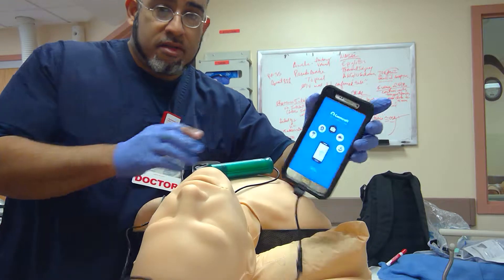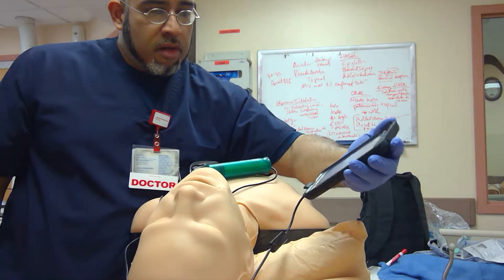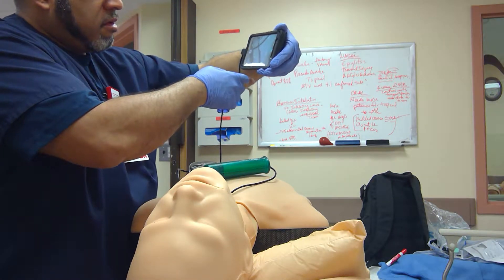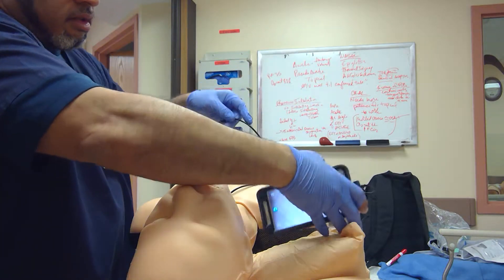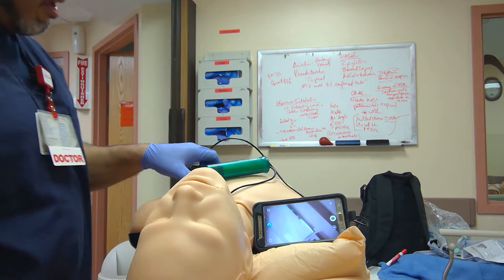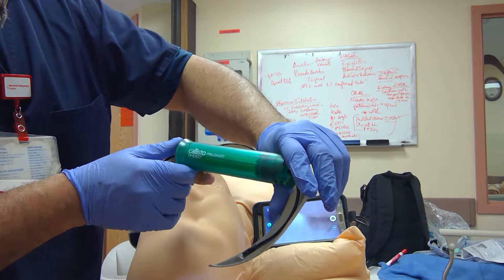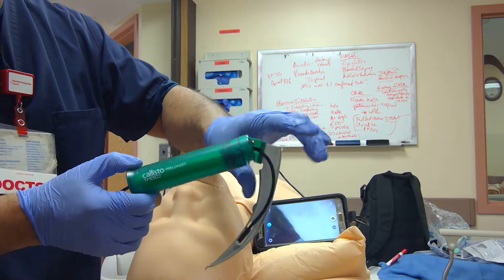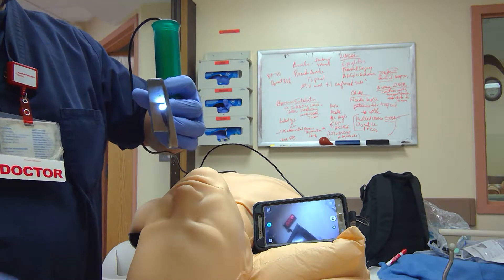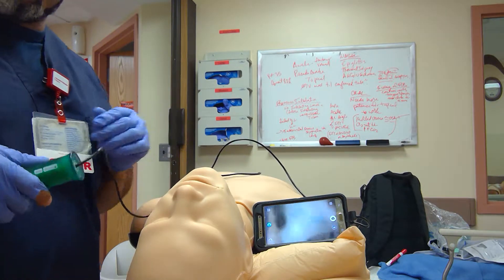So I plug this into the Temesco fiber optic scope and open up the application. Hopefully it's listening to me today — yes, it's turning on now. I'll tilt it on the screen in the manner it will record. I now have a flat panoramic view with this Temesco Callisto scope, which looks good.